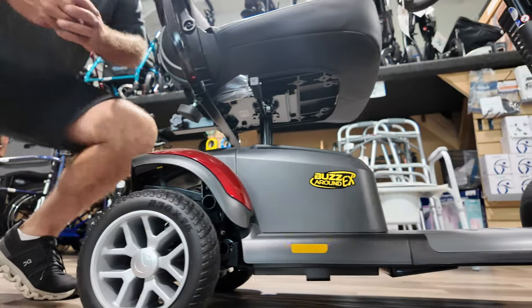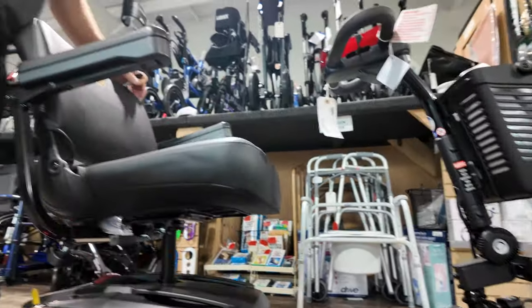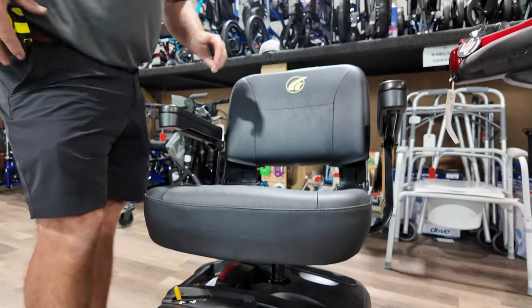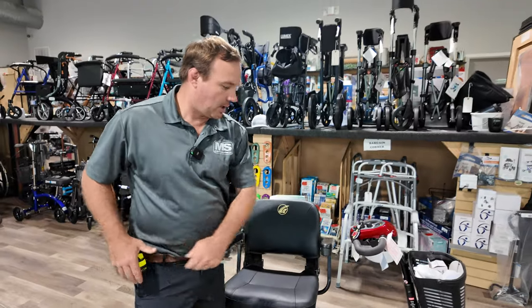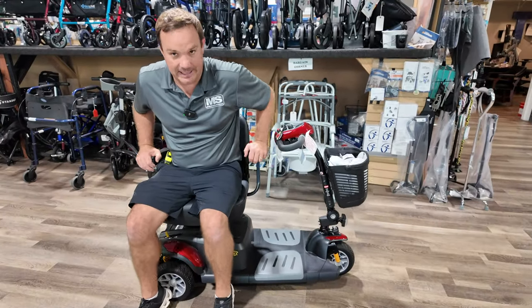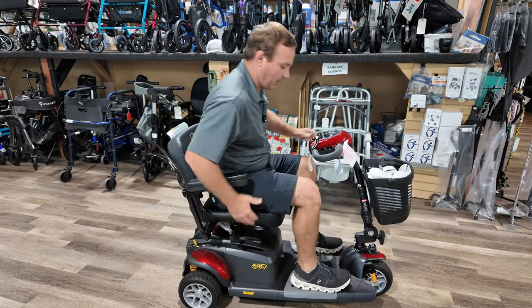It's a nice unit — it disassembles, it's going to have a swivel seat, and it's got good ground clearance. The swivel seat can turn. The three-wheel model is going to be better for going shopping and places like that, especially if you have longer legs — you'll like this. It's important to be able to get in and out of the scooter, and the three-wheel with the swivel seat makes that easy.